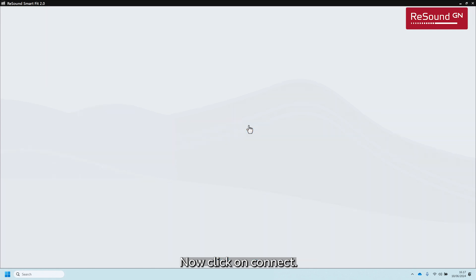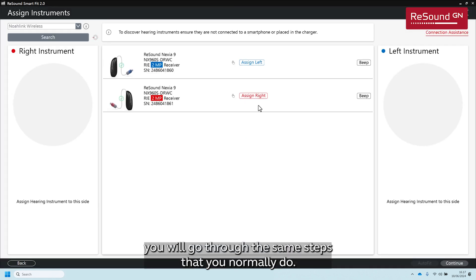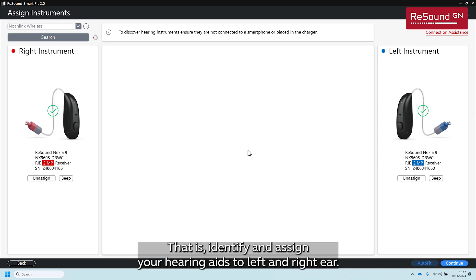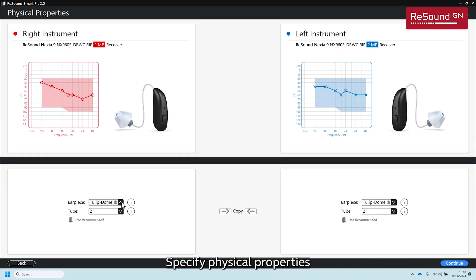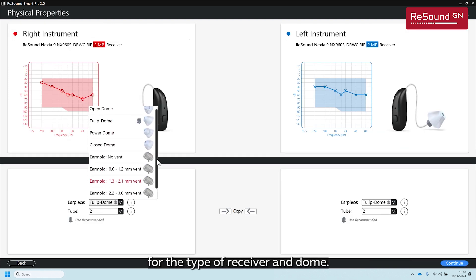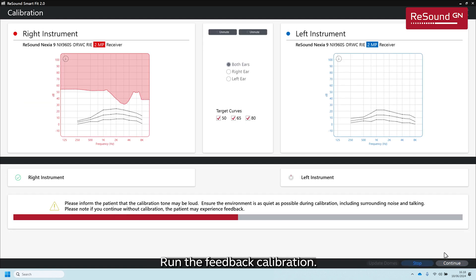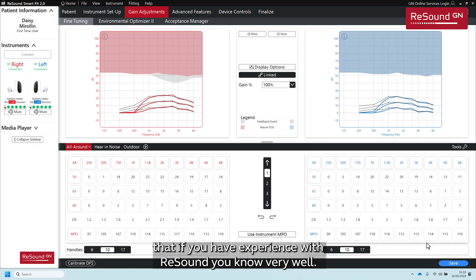Now you can easily identify which hearing aid model you are fitting, the type of receiver, and the serial number — no need to struggle anymore trying to read the serial number directly from the hearing aid. Now click on Connect, and if you are familiar with ReSound, you will go through the same steps you normally do: identify and assign your hearing aids to left and right ear, specify physical properties for the type of receiver and dome, and run the feedback calibration. Finally, you will get to the main fitting screen that, if you have experience with ReSound, you know very well.